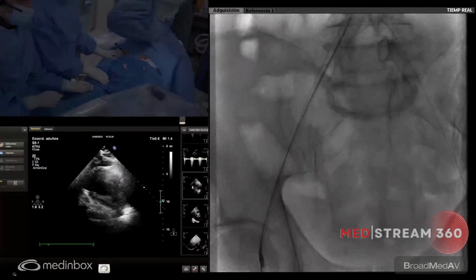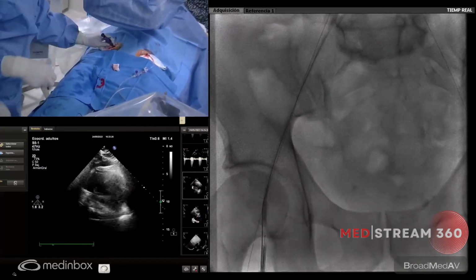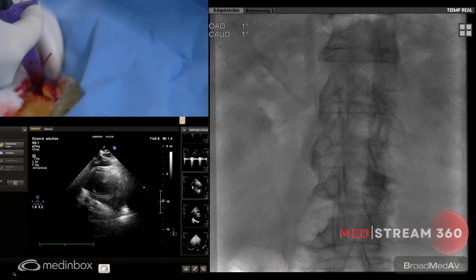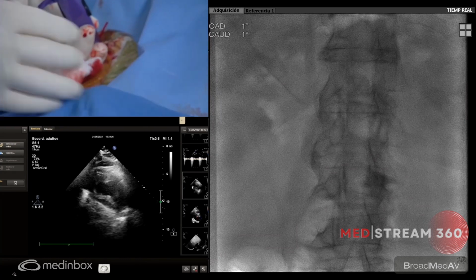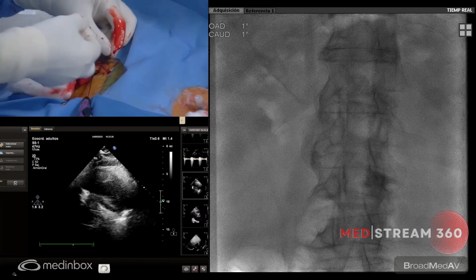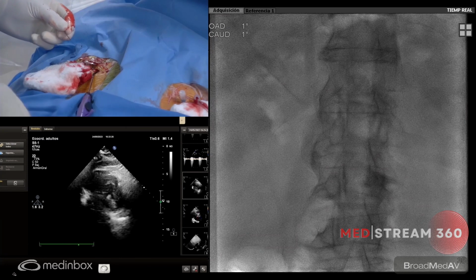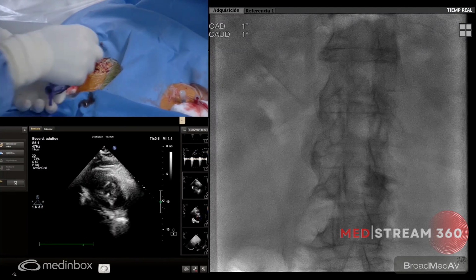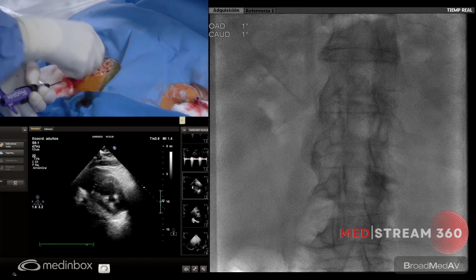So here, when we have a very long distance, it's important you don't have a kinking before entering the artery. So here I'm sure I am in. So I will open and retrieve it, rotate, and let's go with the first. And then we deploy the second. But you know, it's amazing, the distance was almost not enough to get into the artery due to this huge amount of adipose tissue we have here. So we will introduce again the wire to introduce the second Proglide.